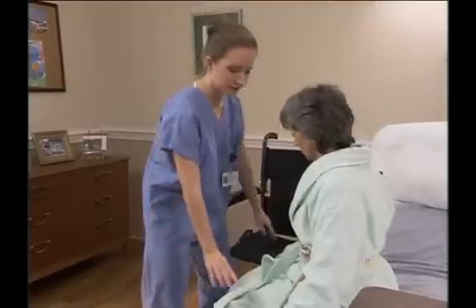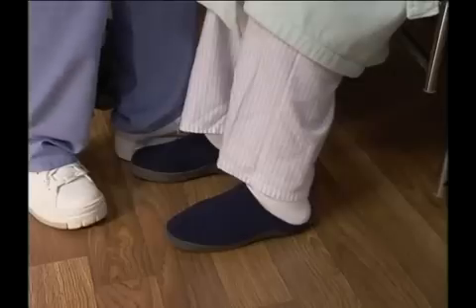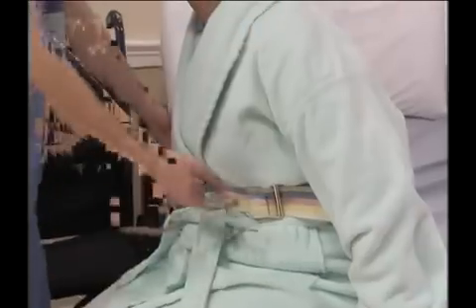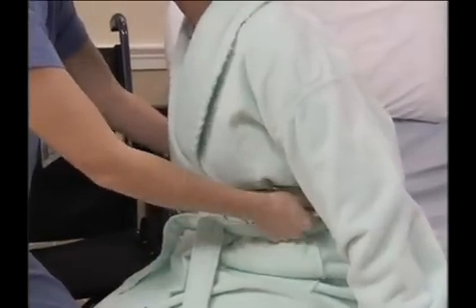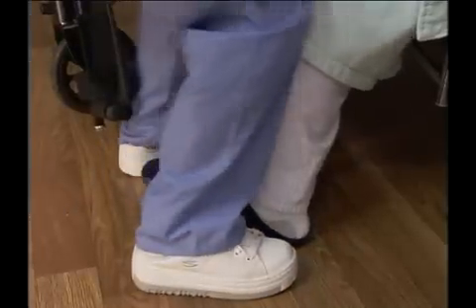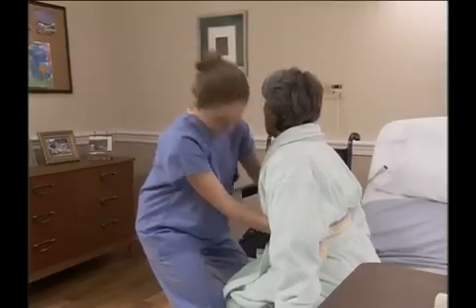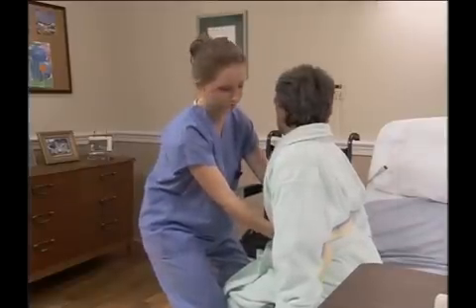Help the person to stand by facing her and having her put her hands on the edge of the bed. Make sure her feet are flat on the floor. Then have her lean forward. Grasp the belt at each side, using an underhand grasp for safety. Position your feet alongside the person's feet, flexing your knees. Your shins will be against the person's shins. This technique helps to block the person's feet and keep her knees from buckling as she stands up.